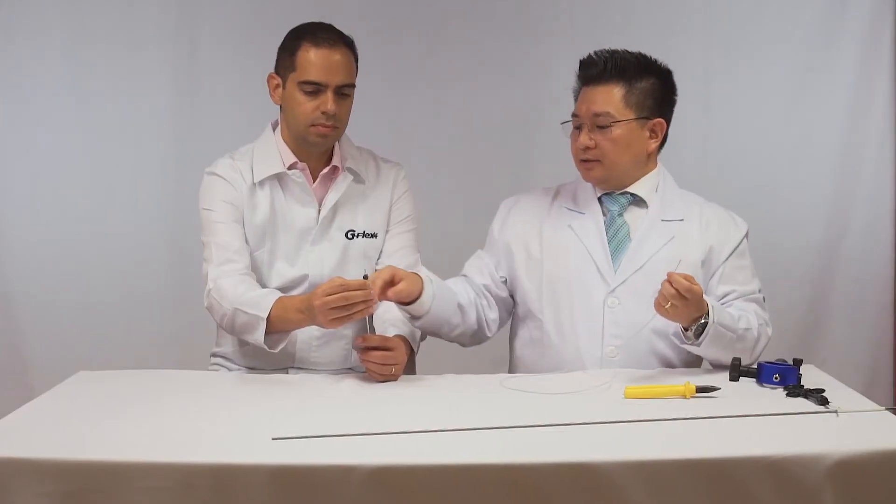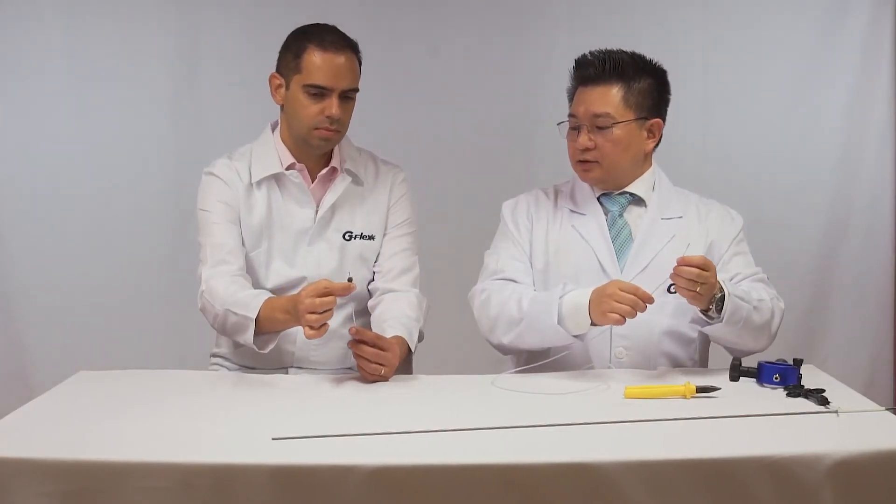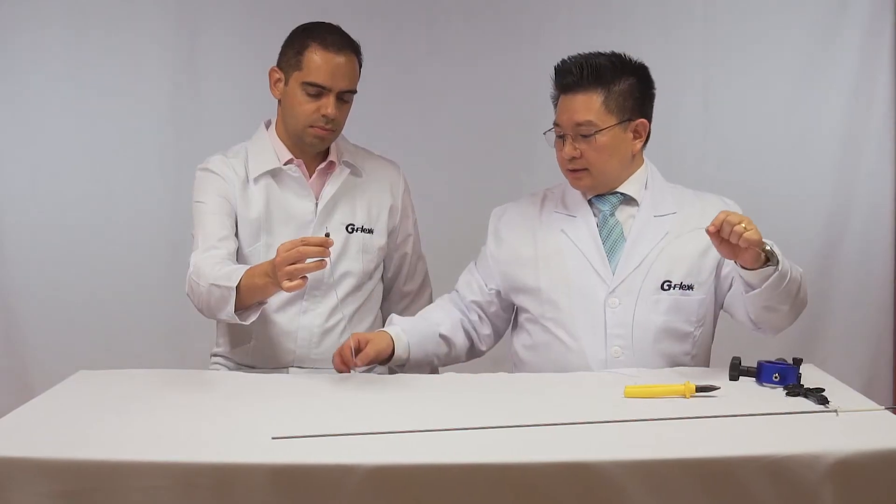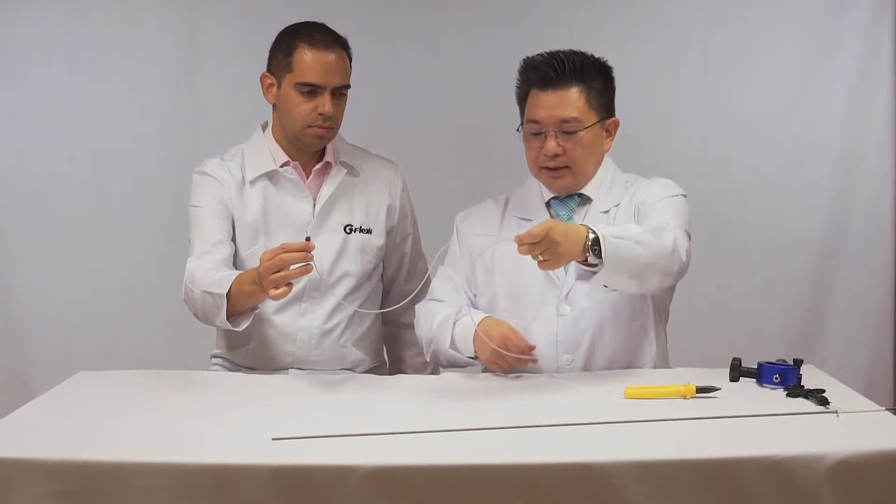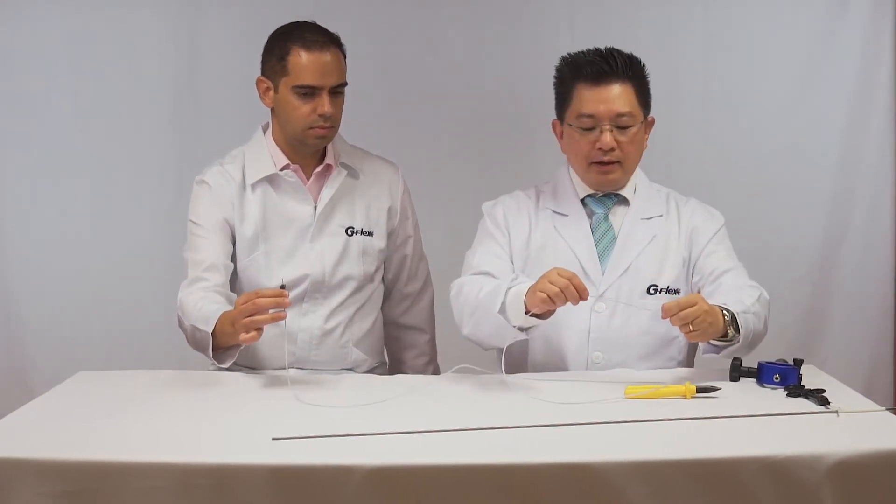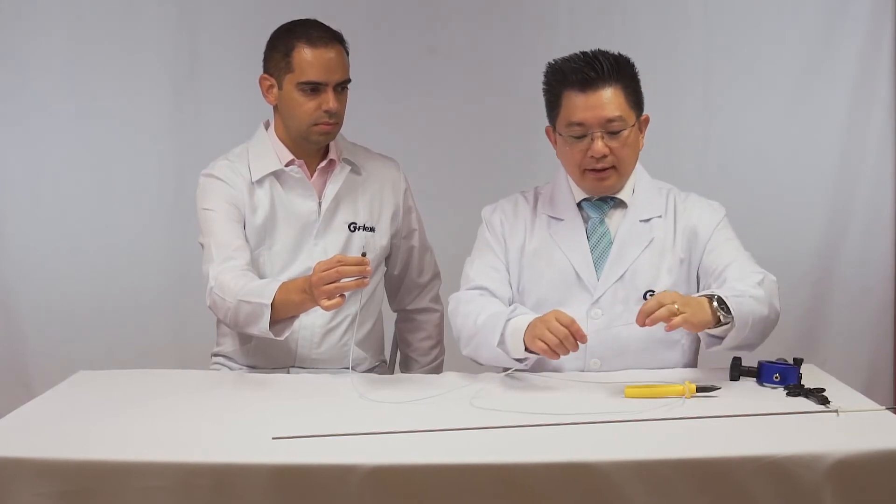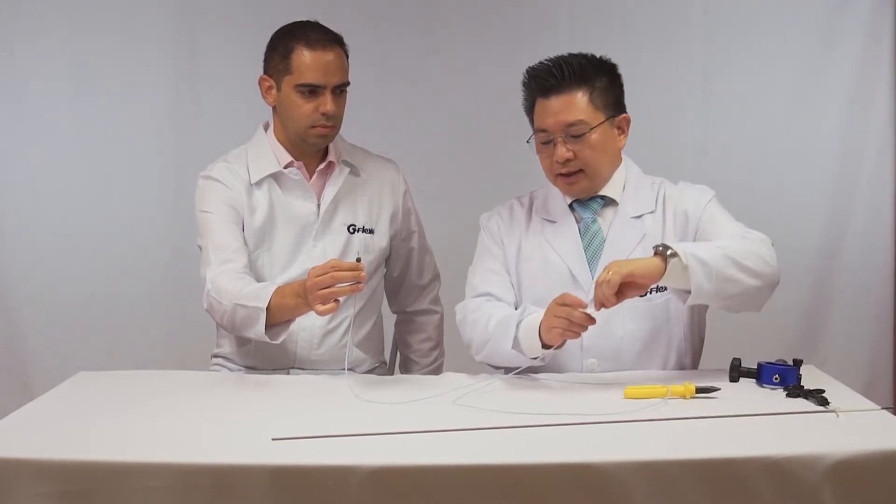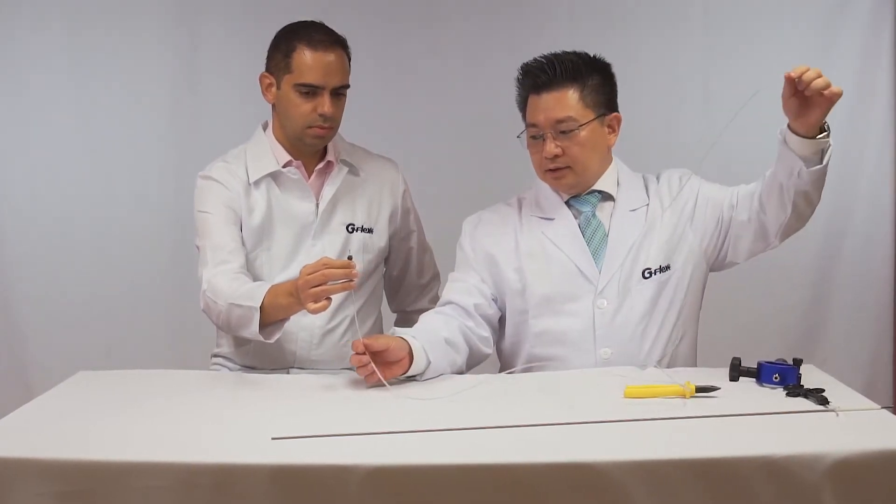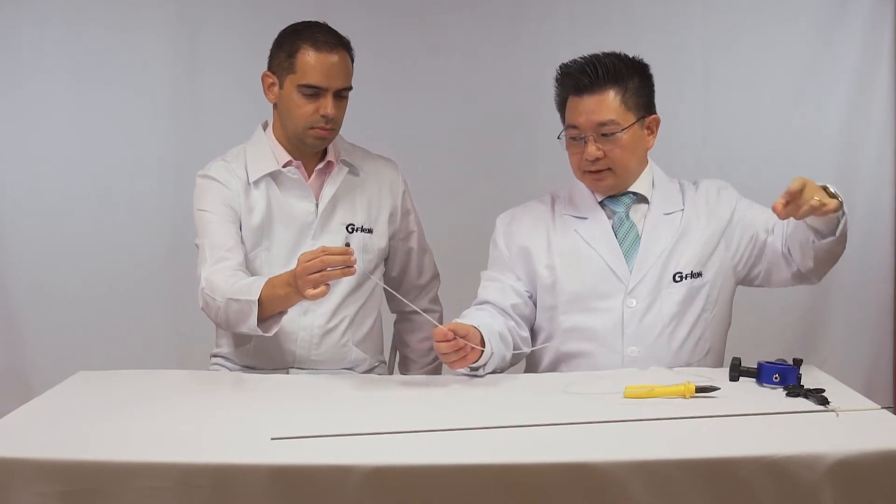Now imagine the stone trapped, we pull out the duodenoscope, it's hanging through the mouth of the patient and we can pull out now the plastic sheath like this.